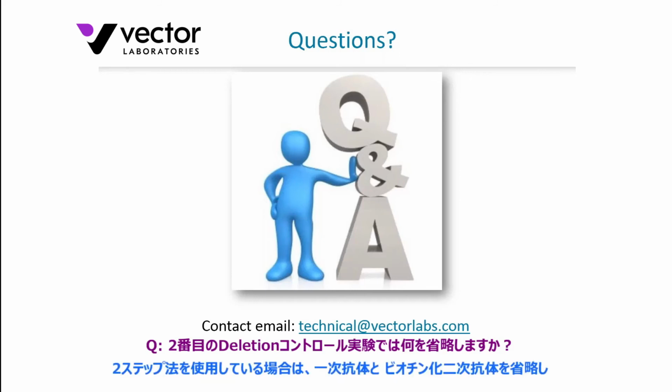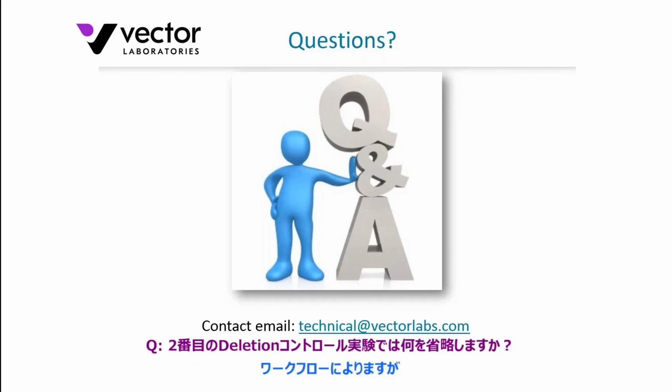If you are using a two-step methodology, you're omitting the primary and the biotinylated secondary, but putting on your streptavidin conjugate, and if you're using an enzyme-based system, the enzyme substrate. So it depends on the methodology you've got there. So that's the first and the second deletion control.